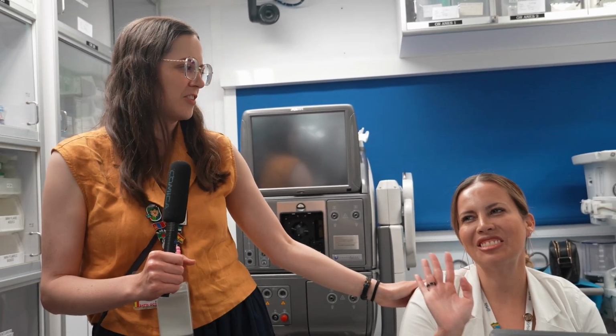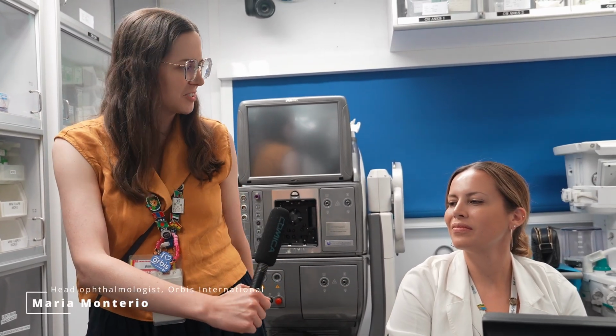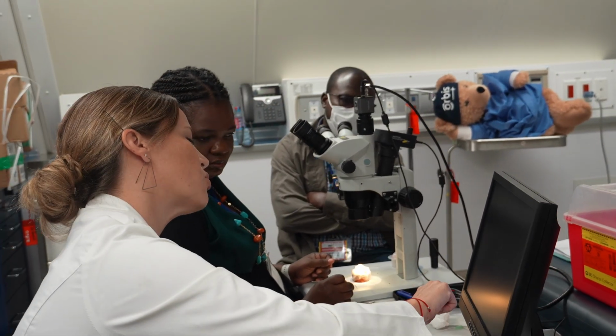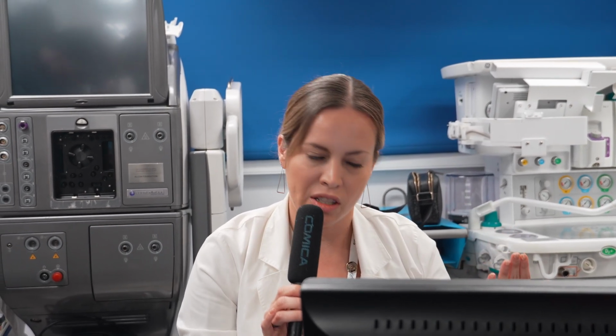So this is Dr. Maria Montero. She's our head staff ophthalmologist for the Flying Eye Hospital. Would you like to share some more about what's happening in here this week? Sure. This week we're doing simulation training with our doctors here from Ghana. Inside this operating room, we're doing the phacoemulsification process, which is to remove the cataract with ultrasound, but we also have a station for manual small incision cataract surgery. This technique doesn't require a machine. It's just the consumables and the doctors doing the surgery.